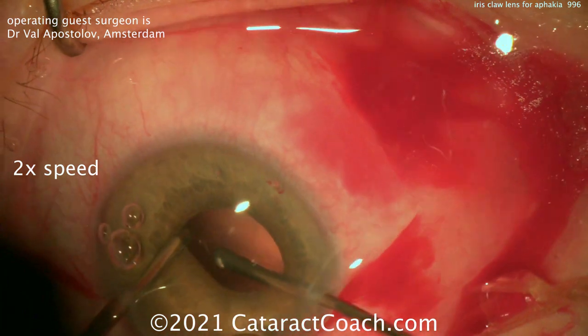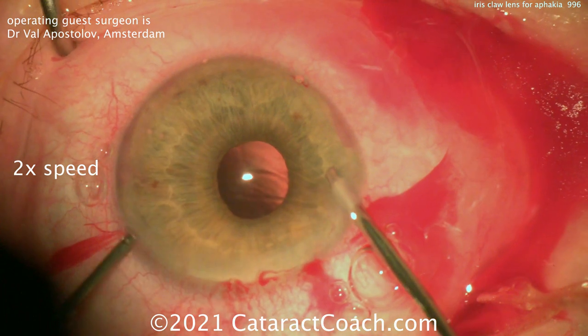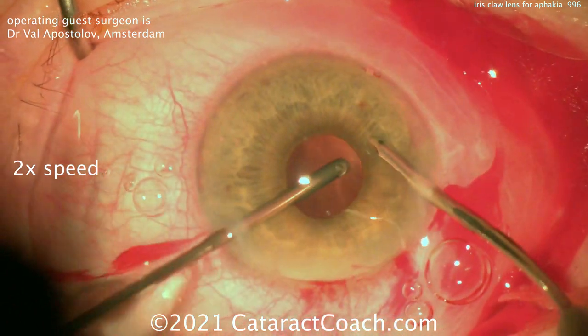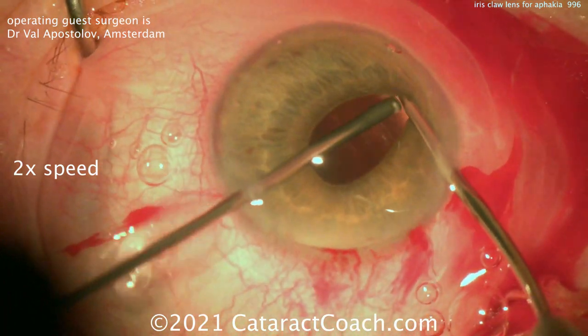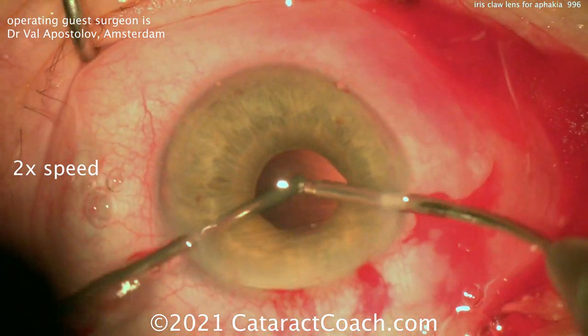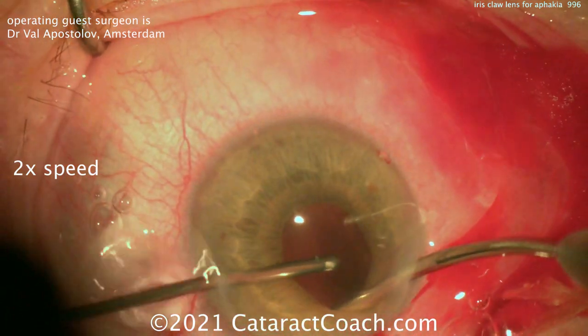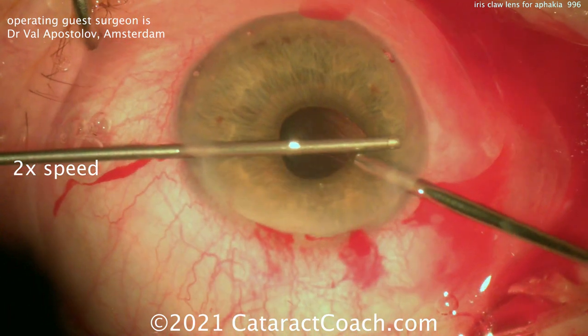You can see the incision was created in such a manner that it's pretty much self-sealing. Once that vitrectomy has been done, we can switch hands and do it the other direction just to make sure it's really thorough. You don't want to have vitreous traction — that increases the risk of cystoid macular edema and increases the risk of retinal break or detachment. You really want that anterior segment free from any prolapsing vitreous.